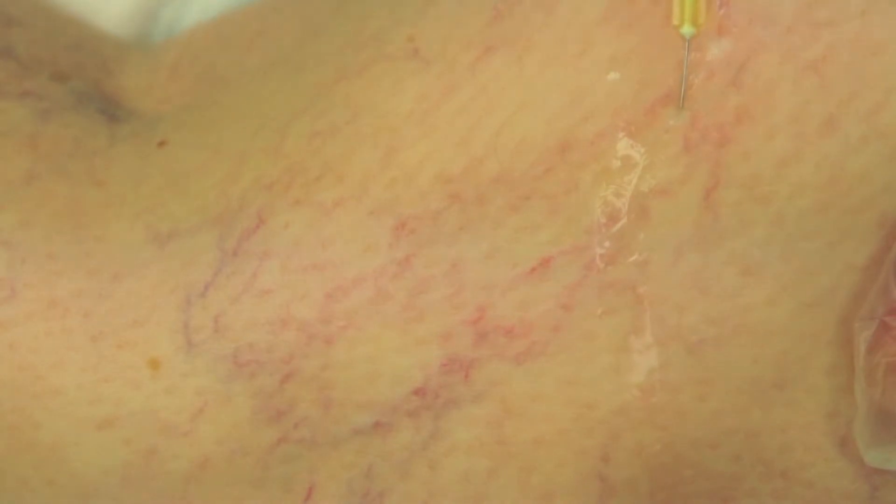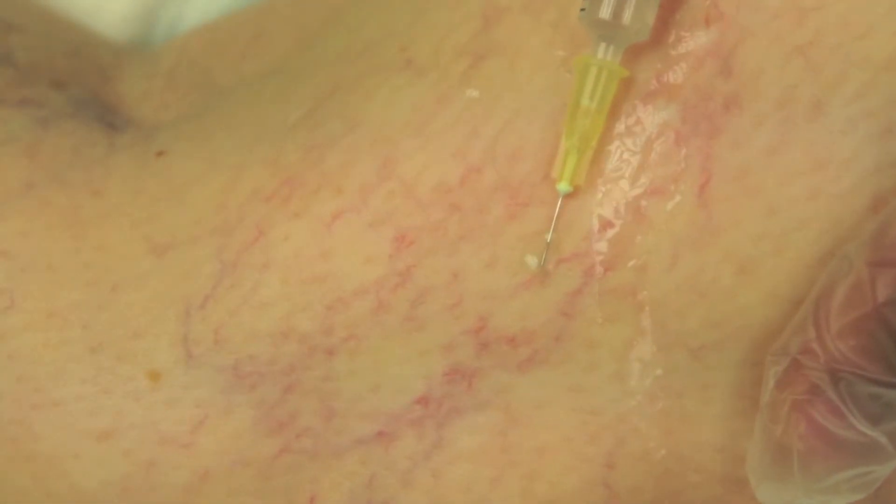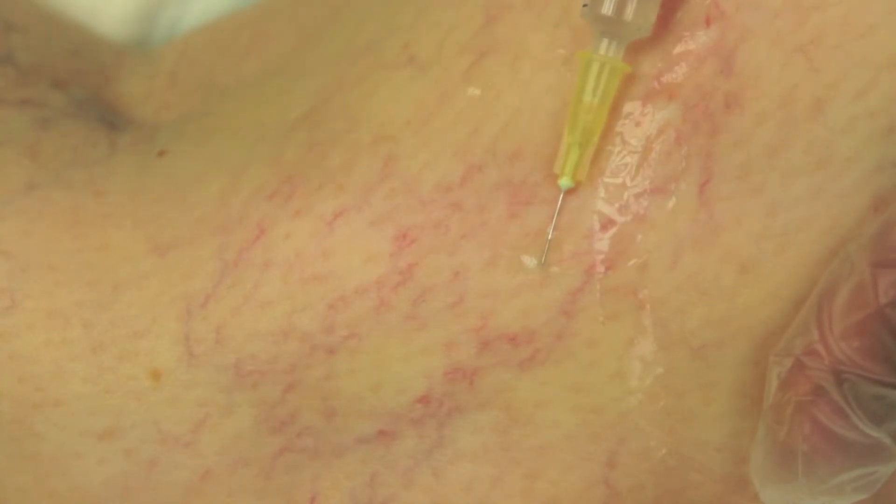The sclerosant works by removing the lining of the vein within a few seconds of the injection, and this initiates a healing process with eventual improvement in the appearance of the thread veins by fibrosis.